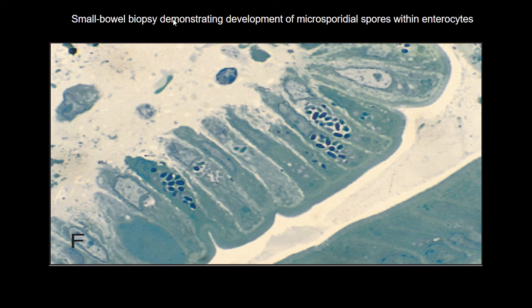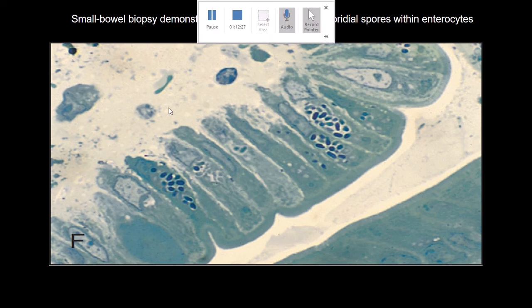So fluorescinated antibodies can be used then in the identification of many of the protozoa in general.